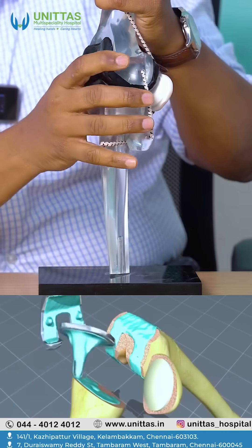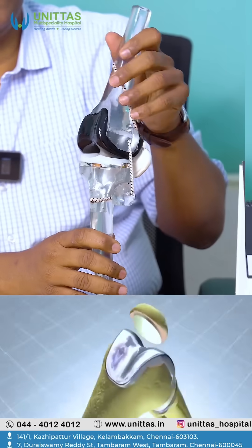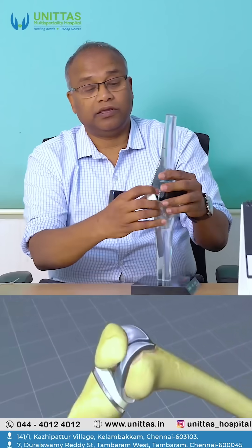Similarly, cement is placed inside the bone here and this is also attached. At the end, you will have bones where the edges will be of metal. This will be metal, and inside, in between, you will have something called high-density polyethylene. So, this is how the knee replacement is done.